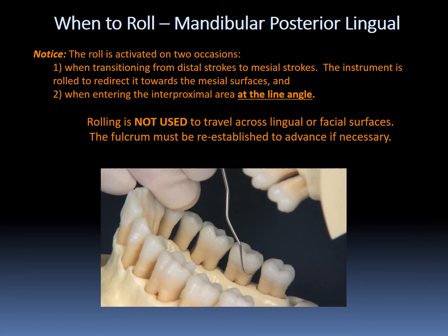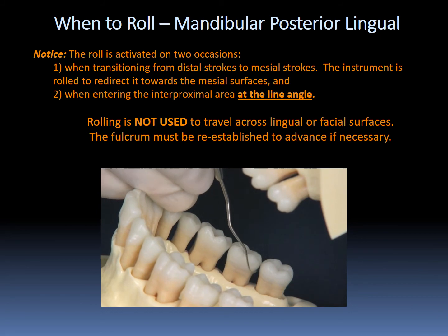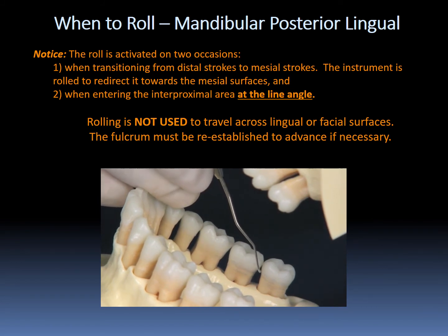Going to adapt this to the distal of the second molar first, and we make strokes by rocking back slightly on the fulcrum, and then rotate your pivot a little bit to rotate your handle toward the lingual. We're doing vertical strokes up the distal to the contact. Now come out and then use your thumb to roll the tip onto the lingual surface, and then we're going to start with oblique strokes across the lingual. When we get to the mesial line angle, roll this instrument with your thumb, and come around the mesial and do vertical strokes on the mesial.